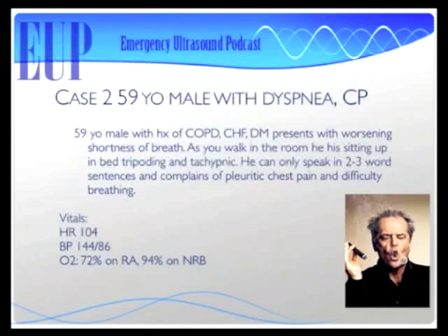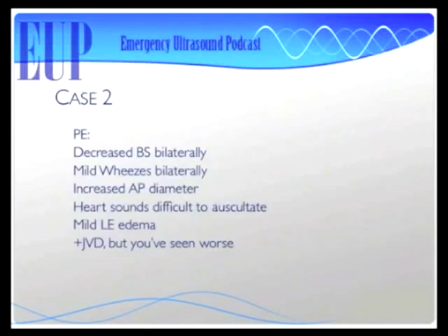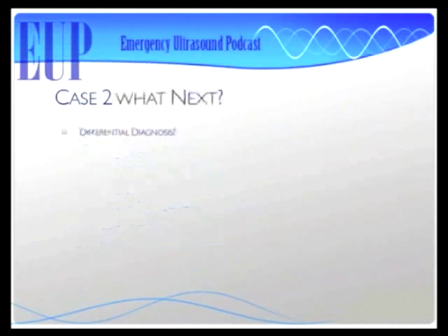I'll let you judge for yourself. In any case, he found a sensitivity of finding bilateral B lines on ultrasound whenever there's an elevated BNP greater than 500, and he found that sensitivity to be 33%. Now, that's not all that awesome, but what is awesome is a specificity of 91.7%. So that's a pretty interesting study that Dr. Manson did down in Emory.